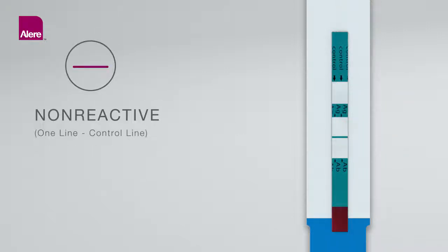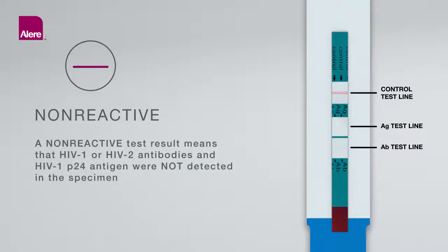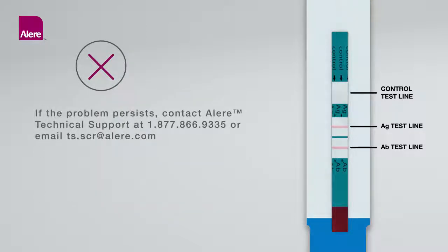Non-Reactive Result (One line: control line): A pink-red control line appears in the control area of the test unit, and no pink-red antibody or antigen line appears in the lower or upper test areas, respectively. A non-reactive result means that HIV-1 or HIV-2 antibodies and HIV-1 P24 antigen were not detected in the specimen. Invalid Result — No Control Line: If there is no pink-red control line in the control area, even if a pink-red line appears in the lower or upper test area, the result is invalid and the test should be repeated. If the problem persists, contact ELEAR technical support.